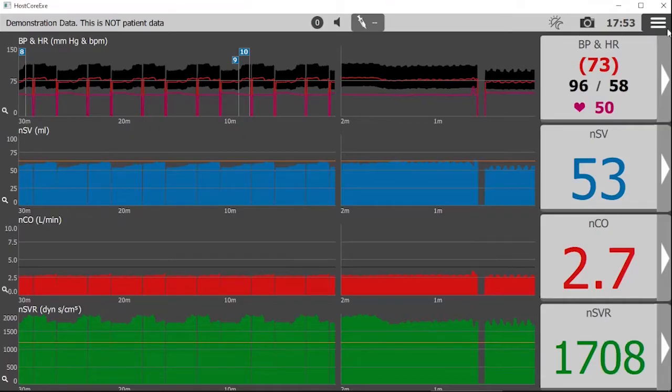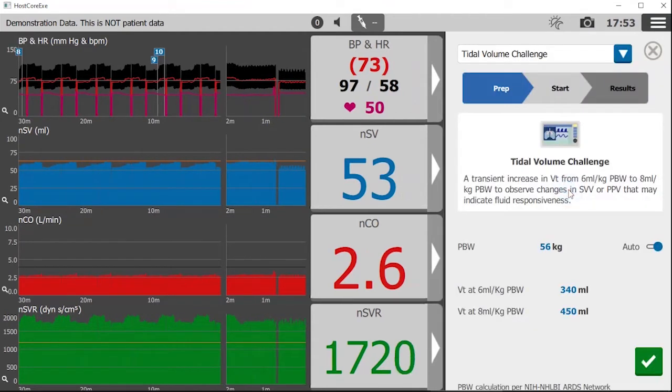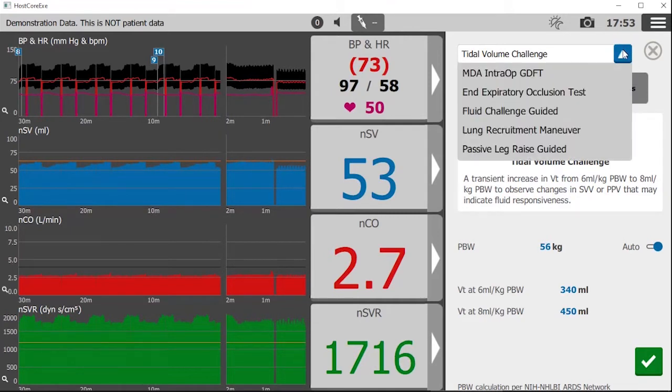Start by selecting the three bar icon at the top right to enter the main menu. Then select protocols about halfway down. Once inside the protocols menu, use the drop-down arrow to reveal the options and select passive leg raise guided.